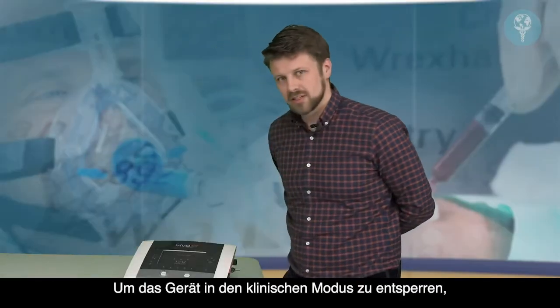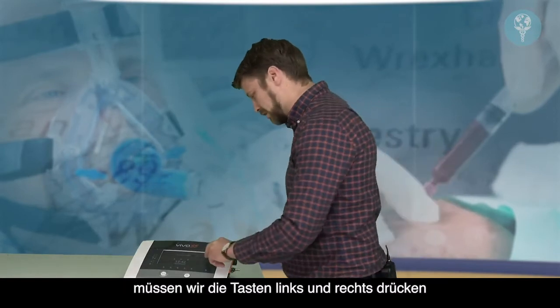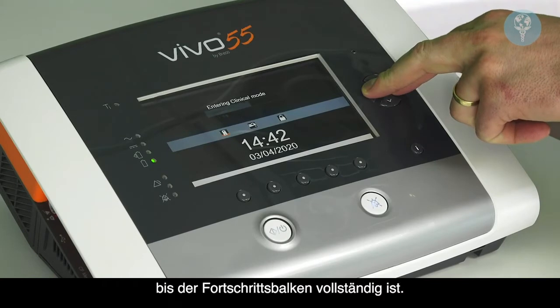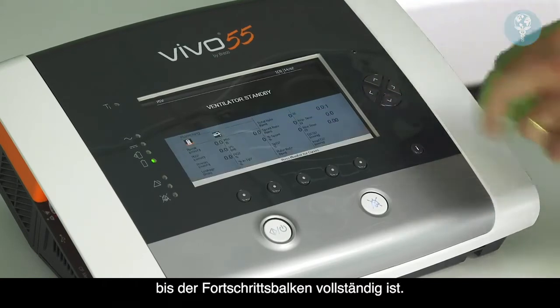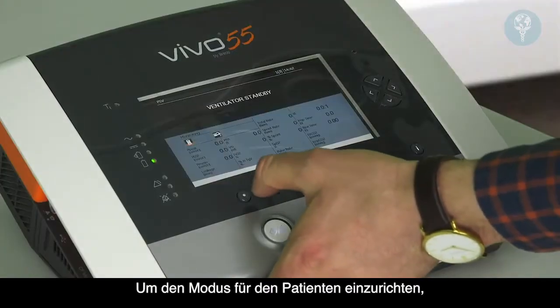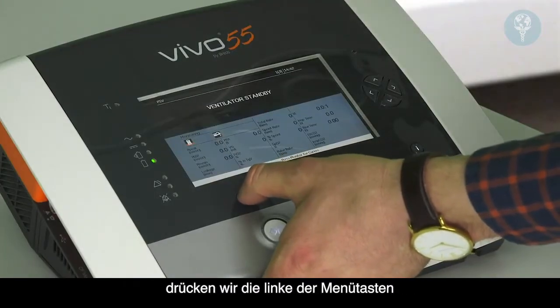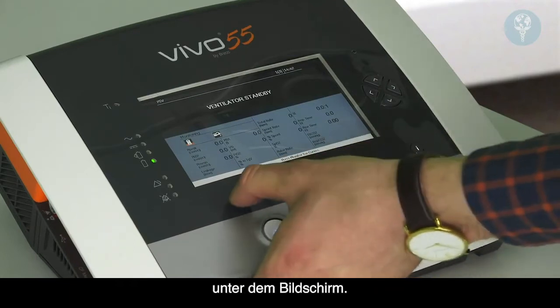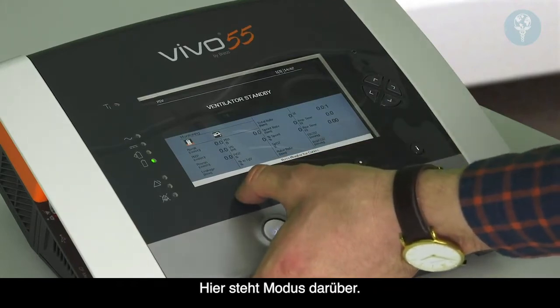So to unlock the device into the clinical mode, what we need to do is press the left and right buttons, press and hold them together until the progress bar completes. The ventilator is now in its clinical mode. So to set up the patient mode, we press the left-hand side of the menu buttons across the bottom of the screen. So this one says mode above it.